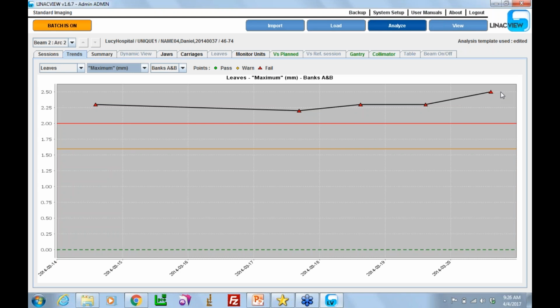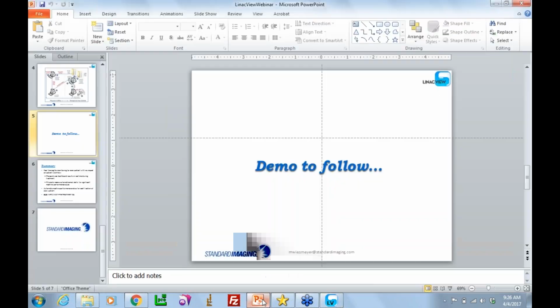What else here? I think that's a pretty good overview right now. Let me switch back and finish up this presentation.